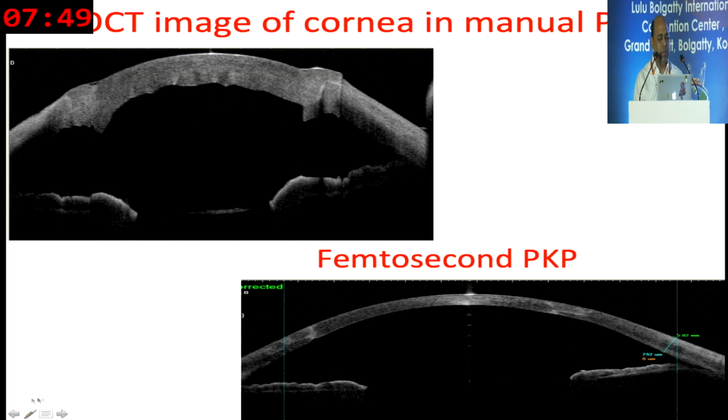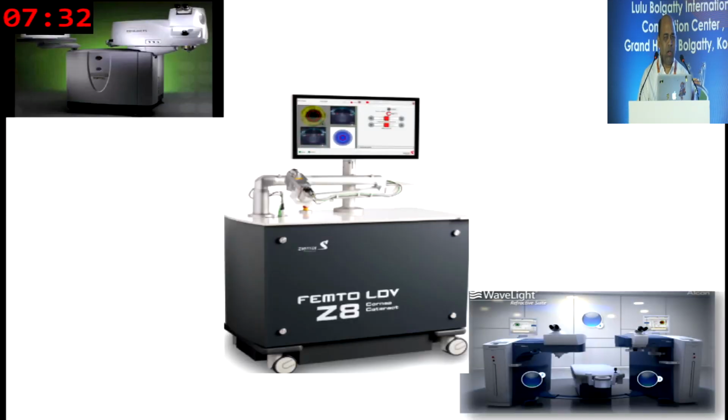If we compare the OCT images at 1 week between manual and femto, you can see the graft and donor are attached very nicely because of this configuration cut. But in the manual, the edges are usually bunched up in the initial post-op period. Now we have different platforms which provide the opportunity to do femtosecond laser, like IntraLase, Femto LDV, and WaveLight.